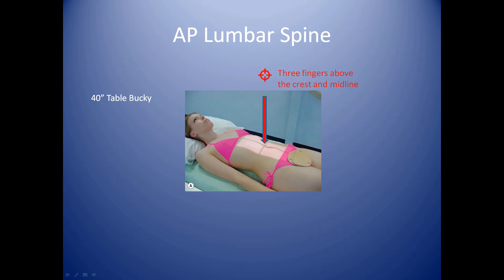Have the patient lying supine on their back. They can bend their knees if they want to, but make sure the knees aren't too high, as their legs can impinge on the image and overlap the pelvis. Remember, we're centering three fingers above the crest and midline with our crosshairs. You are at 40 inches on the table. Close your collimator width to about hip width apart — you're not opening it as if x-raying the abdomen, but closing it in to limit it to the anatomy as much as possible.